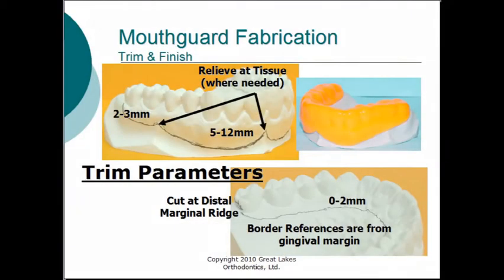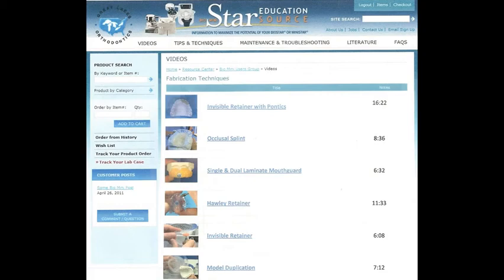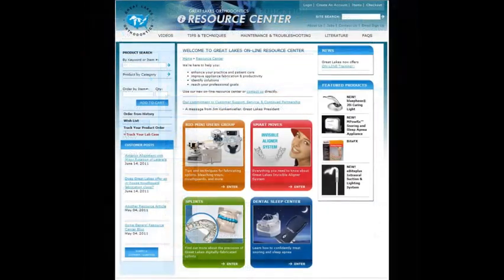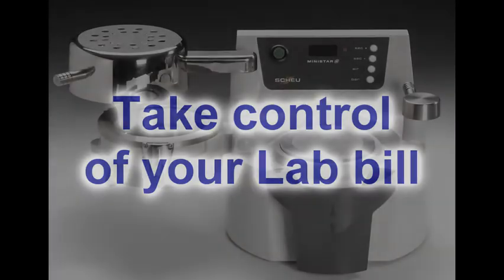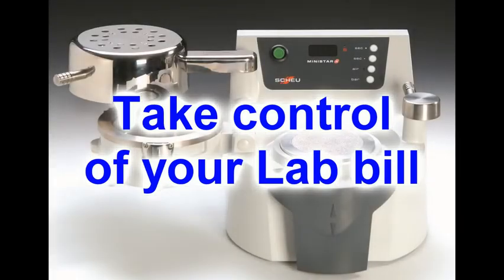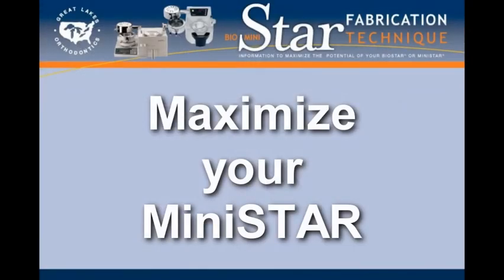The trimming and finishing process is the same for all mouth guards in this training course. These technique videos, along with the other information on the Resource Center, can show you how to get the most from your machine and how to ultimately take control of your lab bill. Maximize the potential of your MiniStar.